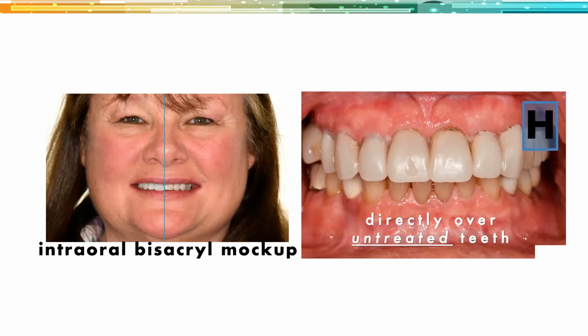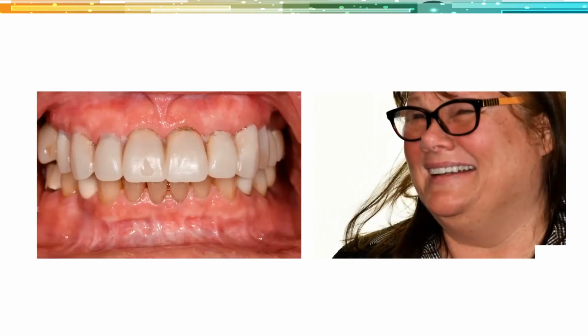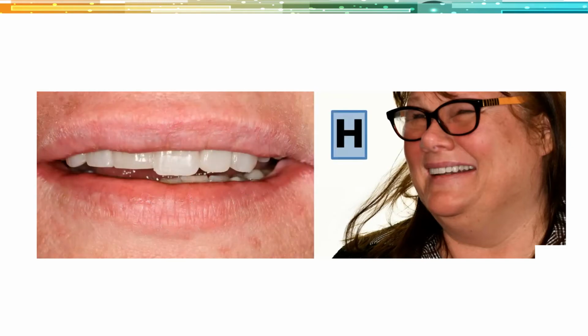If something's way off, we're going to change the design now, before we get to the preps. The way that we figure that out is we go back into our little adapted photo studio setup with the mock-up on. We take our photographs, we try to get the patient to smile. We even take videos sometimes these days. And before we take the mock-up off, we get a 50-50 of the mock-up.